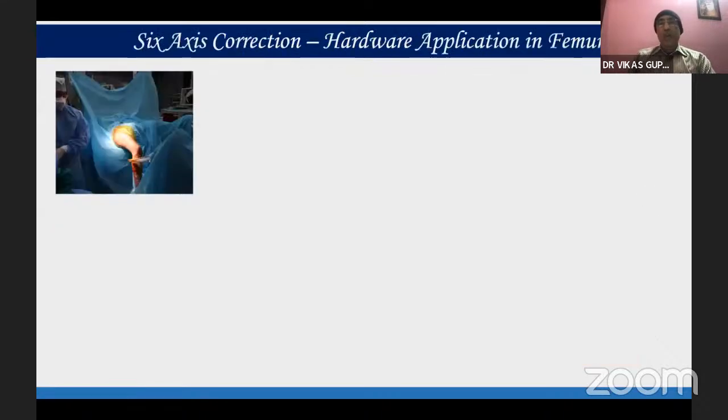So what I do, which I have been following, is my own idea, and Keshav was with me. We flex the knee to prevent contracture and to decrease the knee stiffness. So we pass the Ilizarov wire through the proximal tibia and connect it with a half ring. And I position the femur on a fracture table, and connect it to the frame temporarily. So your knee is flexed and your quadriceps is lengthened while doing the procedure. So you have less knee stiffness. Knee stiffness remains, but less postoperatively.